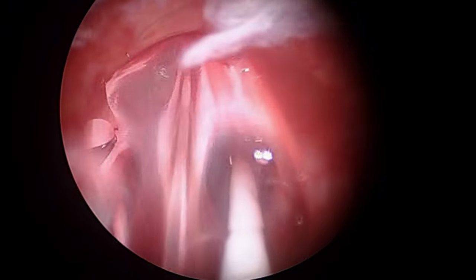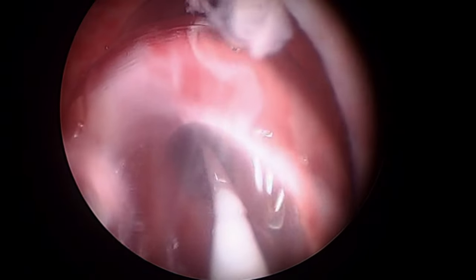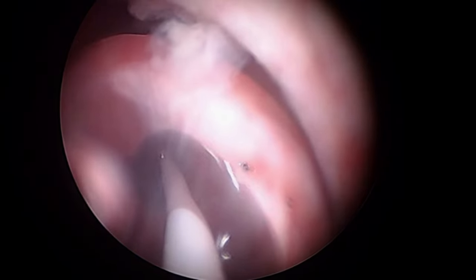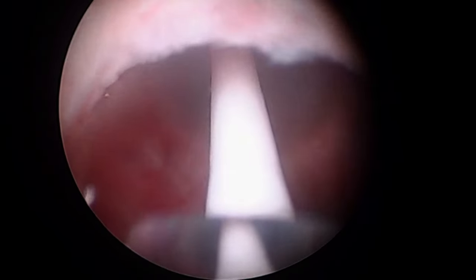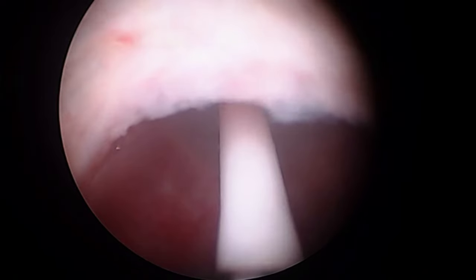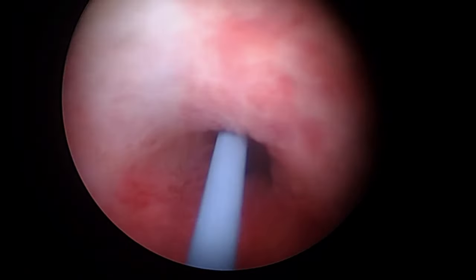As the balloon dilates, it opens the area of the narrowing. Once it's dilated, we keep it dilated for about one minute. We then deflate the balloon and we're able to go in with the scope into the bladder.